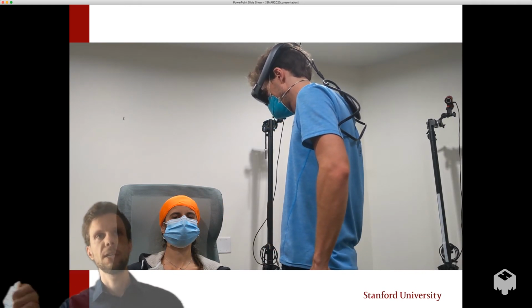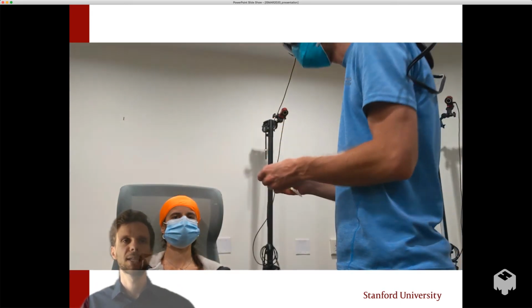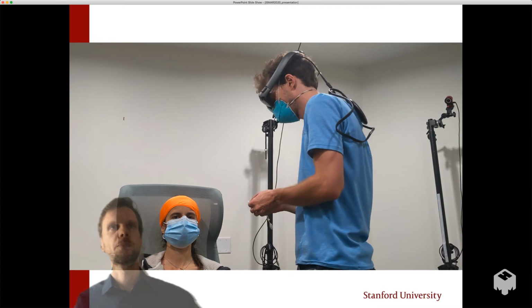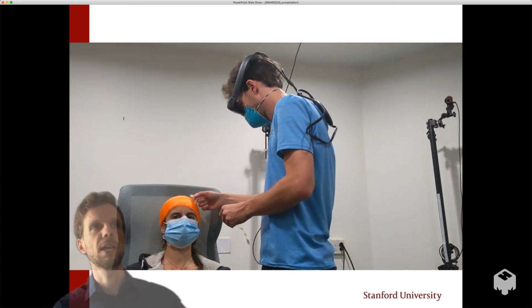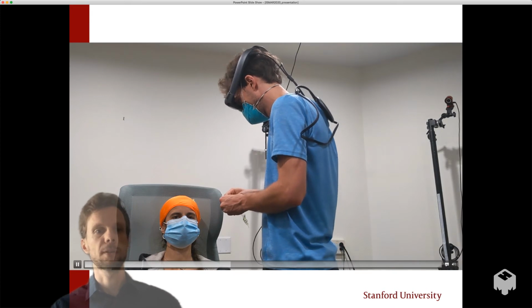Once these virtual fiducials are placed, you adjust the head, and after 10 seconds, 20 seconds, the user already sees the virtual rendering accurately aligned, and then can start placing these MR visible capsules.